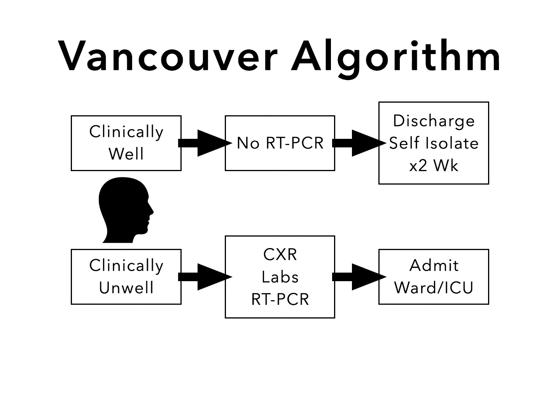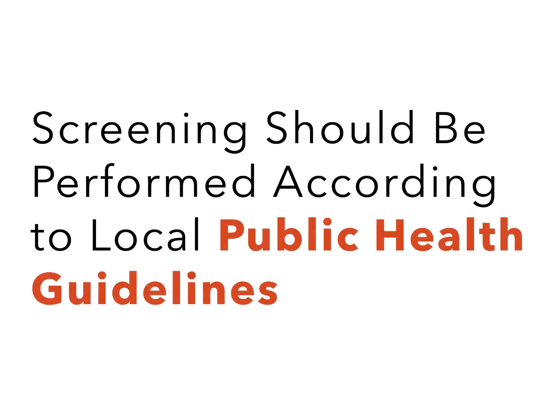In my opinion, lung ultrasound doesn't really change what we do for patients in this algorithm, especially because it doesn't appear as if findings on lung ultrasound necessarily predict a patient's clinical course. At the end of the day, I think screening should be performed according to your local public health guidelines.